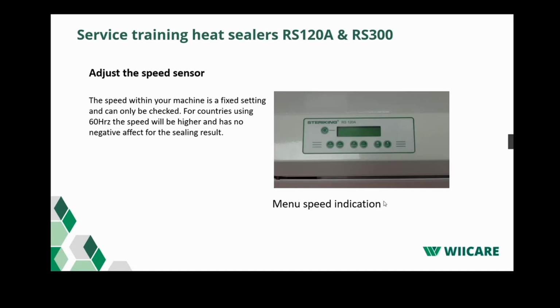The next part is adjusting the speed sensor. There's not very much to calibrate on the speed because the motor is a servo motor, which is just a fixed driven turning rate. What you would see in countries where 60 Hertz is used is that the speed of the motor will run slightly quicker. This has no effect on the sealing result of your pouches, but it's just something to be aware of when you measure the speed.